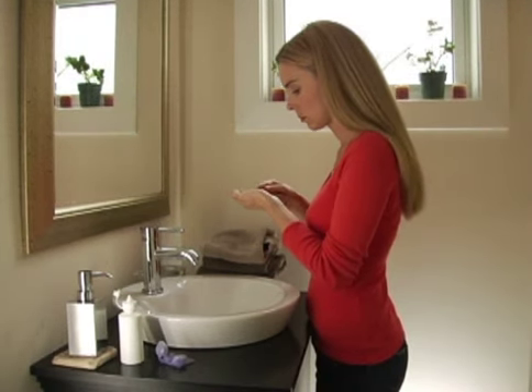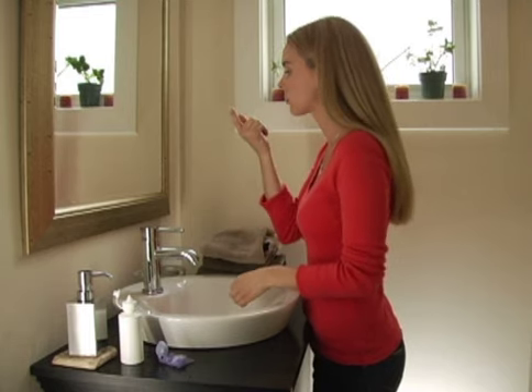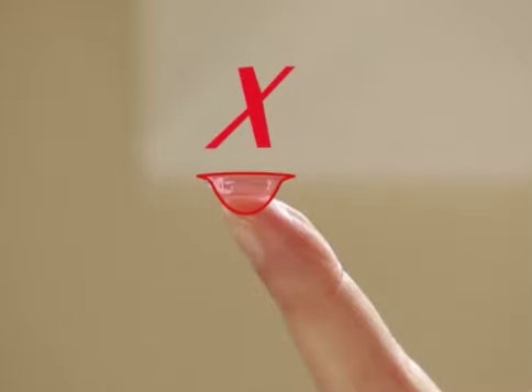Place your contact lens with the cup side up on the tip of the dry index finger of your right hand. Make sure that the lens is right side out — you should see the lens's edge almost straight up. If the lens is inside out, the edges will bow out slightly. If this is the case, make sure to reverse the lens before proceeding.